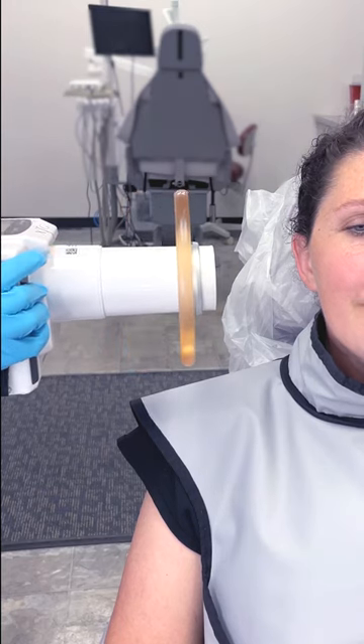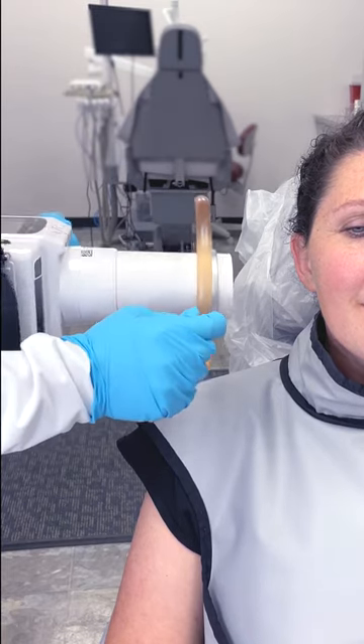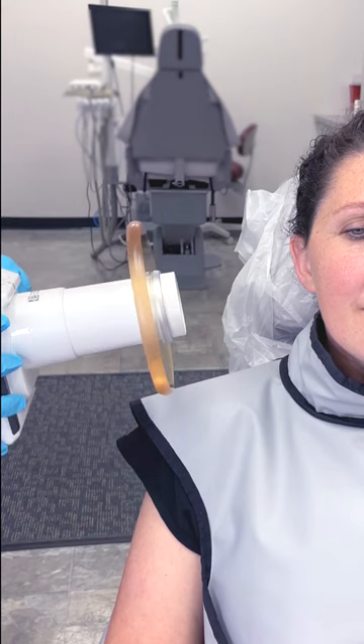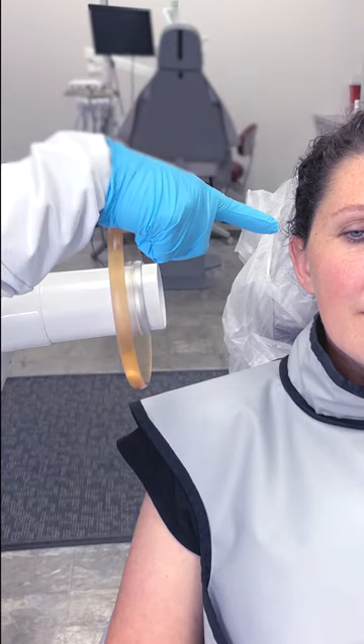When using the DigiDoc XTG system, you want to make sure that you are parallel to this safety ring so the unit is perpendicular to yourself. How you maintain the unit perpendicular and the safety ring parallel is to have your patient move.